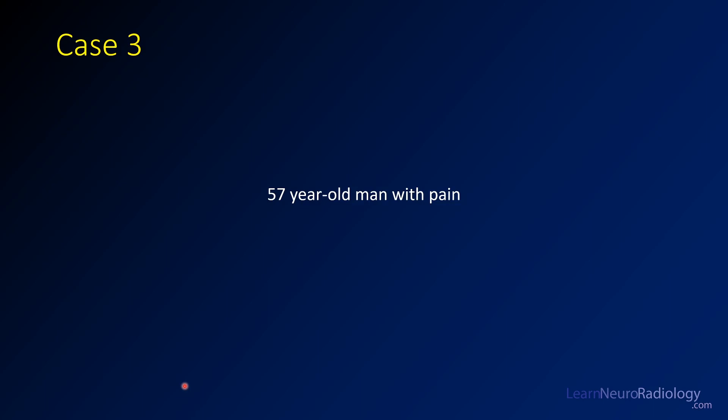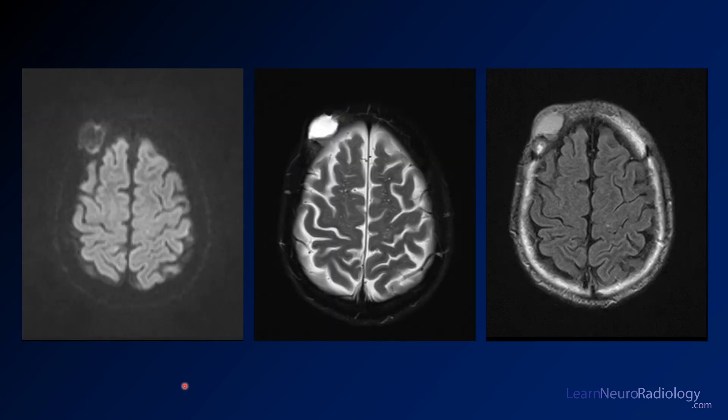This next case is a 57-year-old man with pain. In typical fashion we do not know where that pain is located. Here we have some images from an MRI of the brain. We have a diffusion on the left here, a T2 fat sat in the middle, and a FLAIR on the right here.